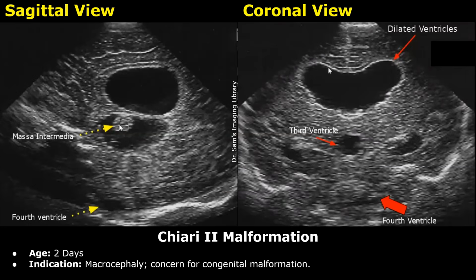Here is a report of Chiari II Malformation. Patient's age is 2 days. Indication, macrocephaly, concern for congenital malformation.